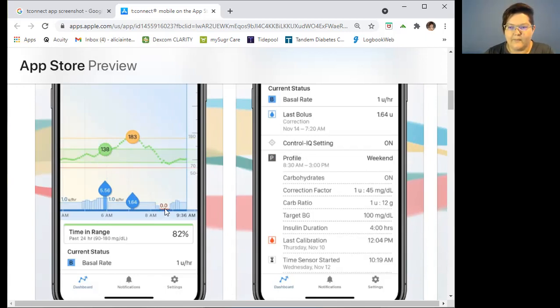And I said, wow, look at that. From this light line to this light line is an hour. Well, more than half of that is missing, because this is my program from 1 across to 1, and look at that big gap. There's about half an hour's worth of basal missing there. So I can say, my programmed basal is a 1, and I can pretty safely add to this bolus that half hour of insulin that I missed. I can add a 0.5 onto my total.